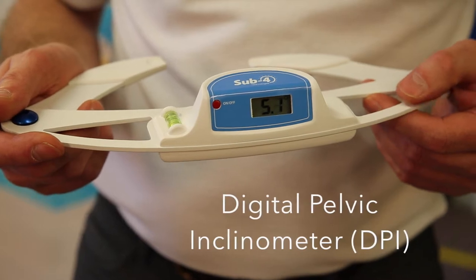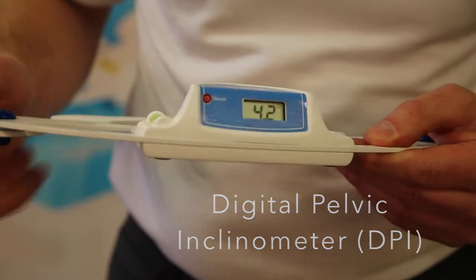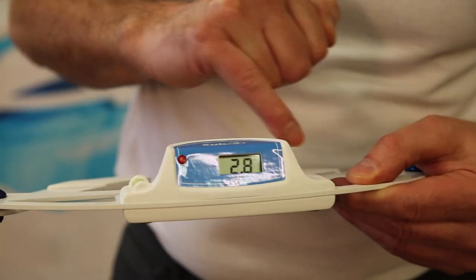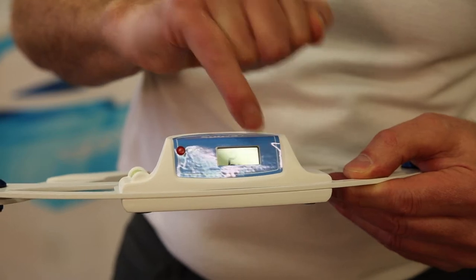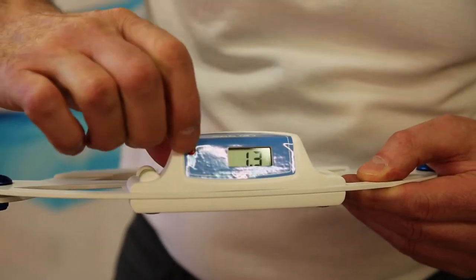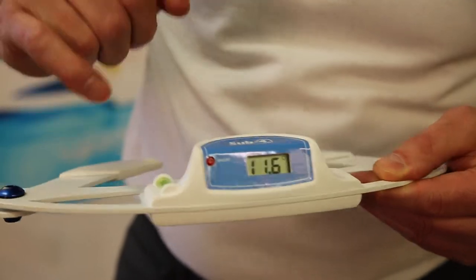The digital pelvic inclinometer is a handheld non-invasive device used by practitioners to measure pelvic torsion on their patients. The housing has a three-axis accelerometer inside it which measures the displacement of gravity in all three planes, giving you a numerical reading on the LCD screen.